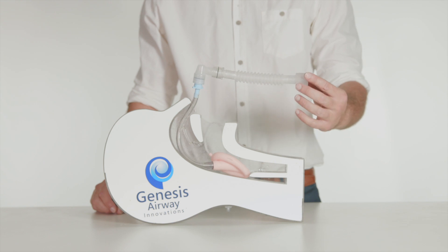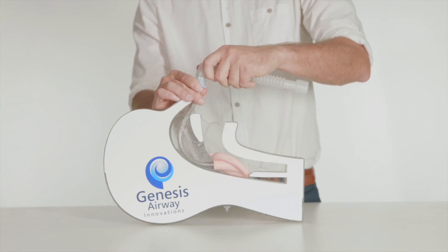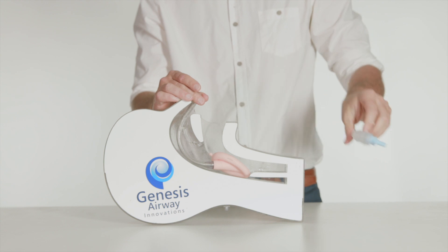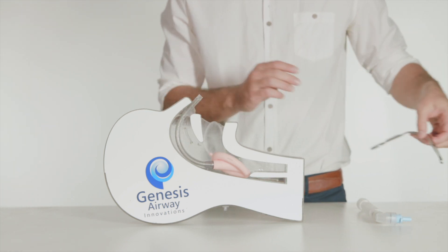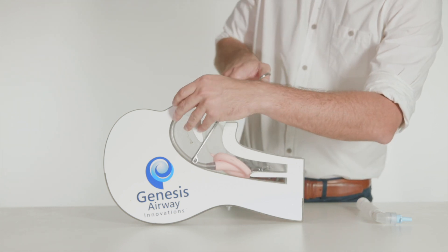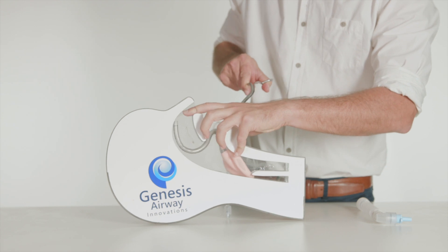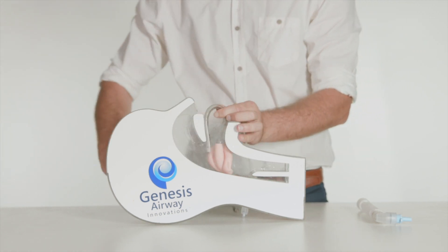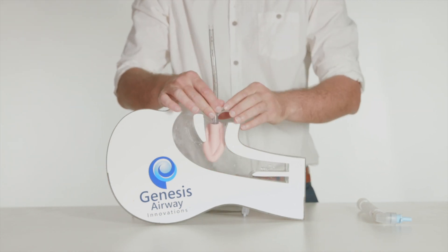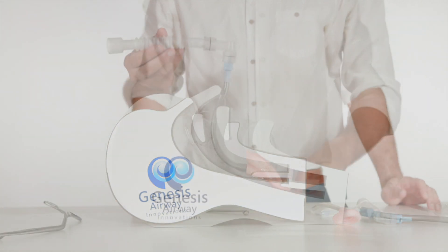We are often asked during presentations how to quickly remove the nasal LMA. This is a simple and quick procedure. Remove the 15mm ISO connector from the proximal LMA airway tube. Using a laryngoscope to visualize the LMA tubing in the oropharynx and using fingers or McGill's forceps, grasp the tubing and pull it out of the mouth. This will deliver the LMA mask from the laryngopharynx and at the same time the LMA tubing will be pulled through the nasopharynx.